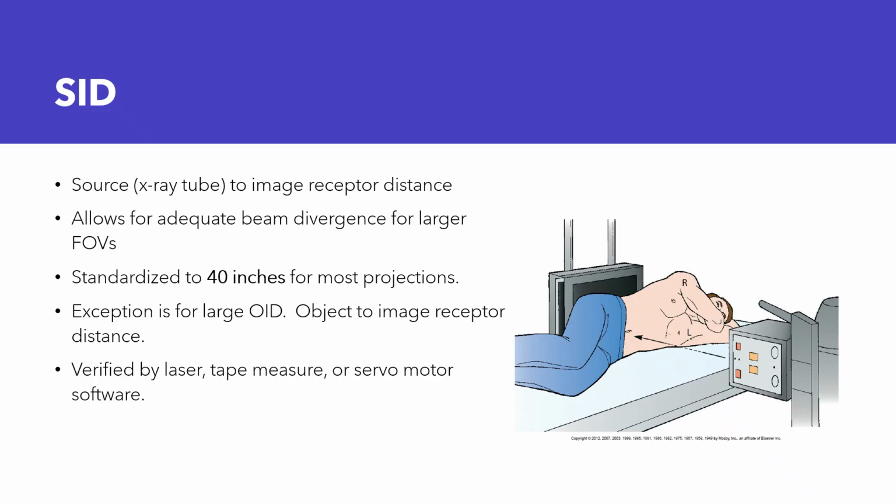So that's our X-ray tube. That's our machine. It's blasting out this radiation in a beam. Okay? Very similar to a flashlight. Except you can't see the components of the beam like you can with a flashlight. It's not visible to the human eye.